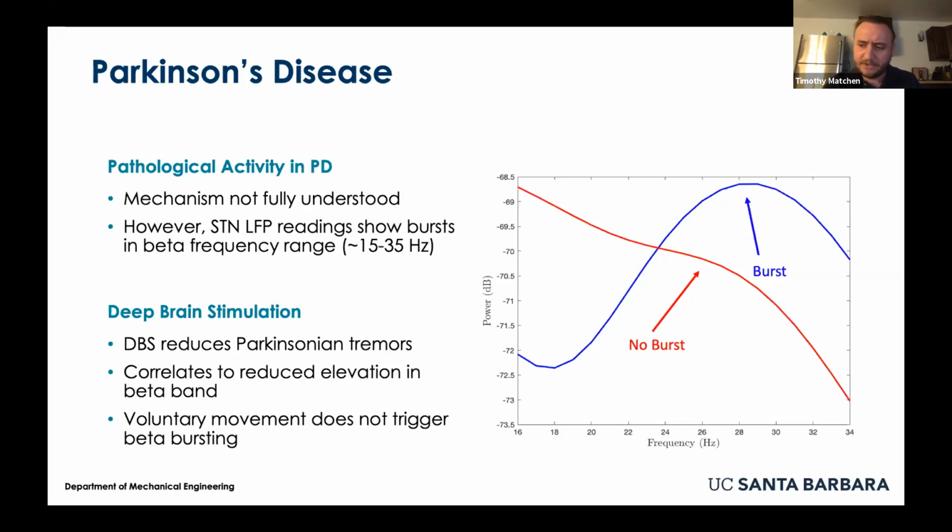And it's not efficient on two levels. The first is that to actually set up deep brain stimulation for a patient, the patient has to go through a manual tuning procedure with a technician, where they'll adjust the frequencies and the amplitudes of the stimulation to find parameters that best work for that specific patient. And this is somewhat of an unwieldy process.